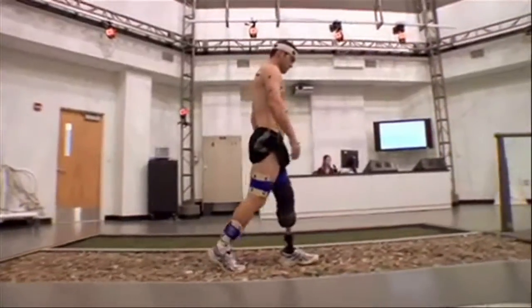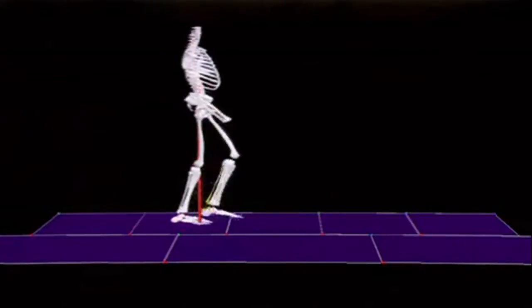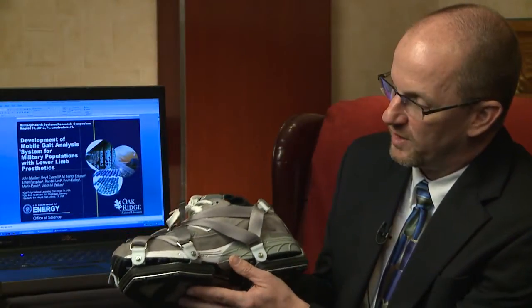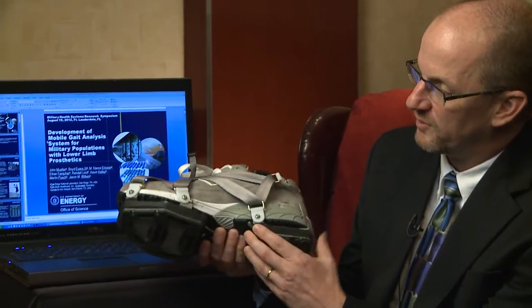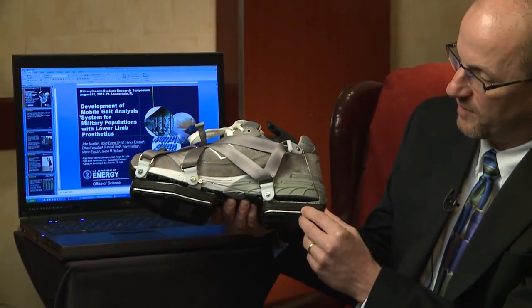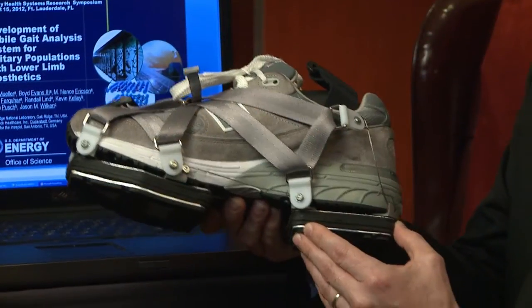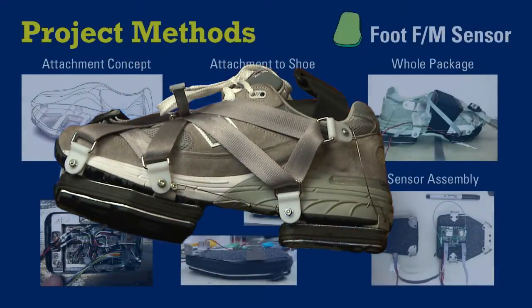This process is typically done with plates hidden in the floor that can collect the forces — we call them ground reaction forces — as the subject walks over the plates. What we've done with the shoe is take the technology of the force plate and made a device that fits right on the bottom of the shoe, incorporating a very accurate method of both isolating and measuring those forces.